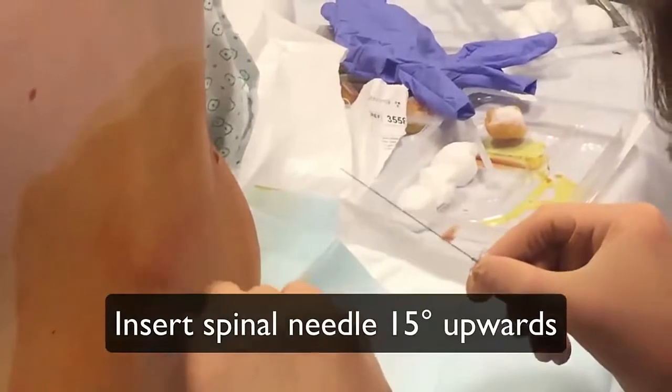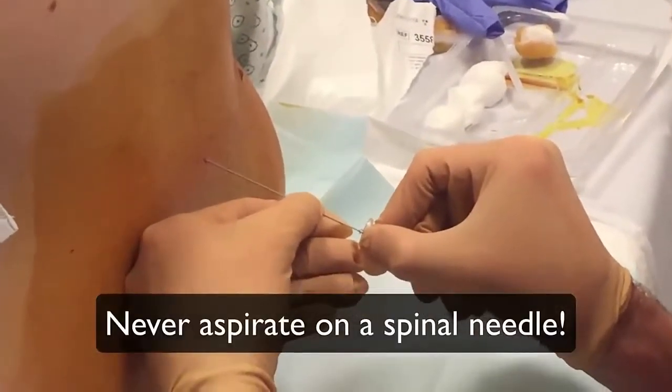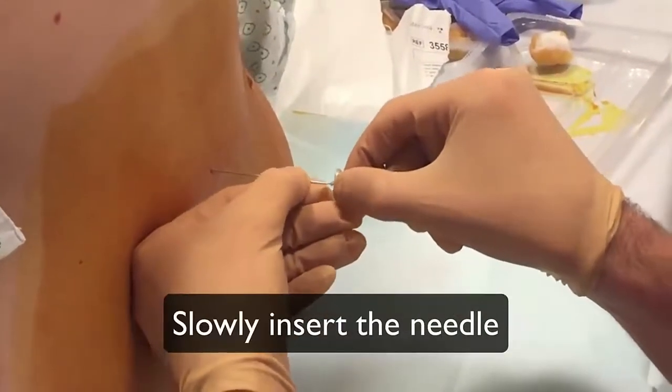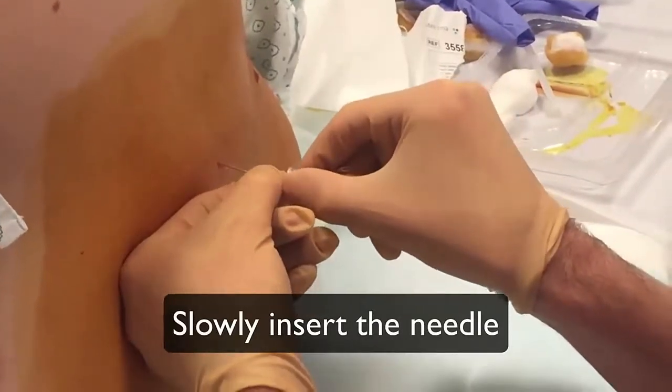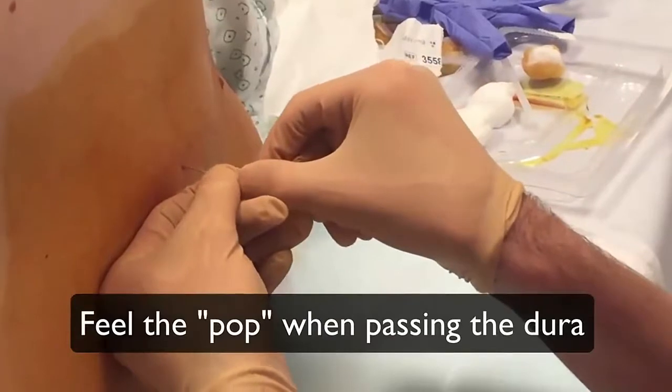Insert the spinal needle in the midline and 15 degrees upwards. Never aspirate a spinal needle. Slowly insert the needle deeper and regularly retract the needle introducer to see if fluid comes out. You might feel a pop while penetrating the dura.